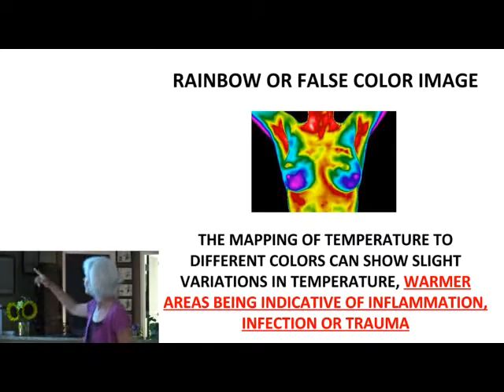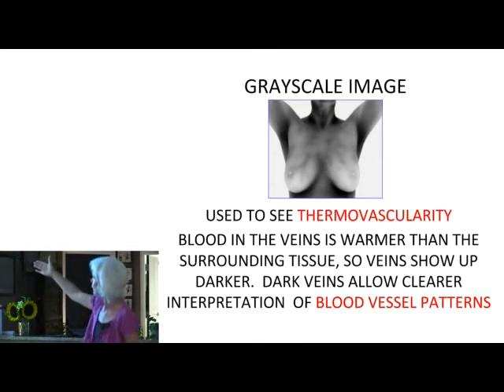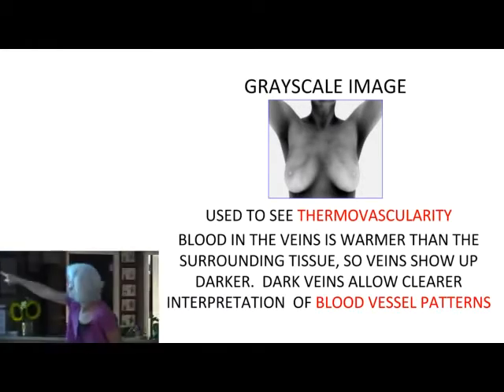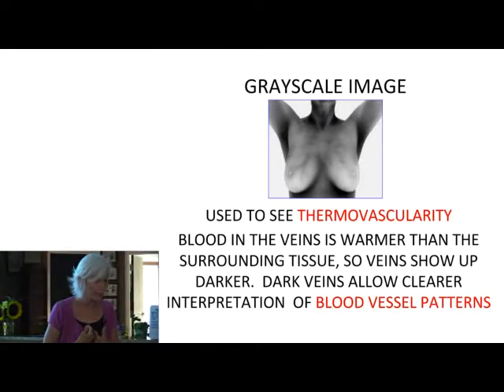So Effie, let's go on here to the grayscale image. We also view the images in grayscale. When I say physiology, this is better representative of what I'm trying to relay to you. This shows the blood vessel patterns. Do you see in the black and white? I'm going to show some more black and white, but this is called thermovascularity. What this means is the blood in the veins is warmer, so it shows up in this black and white. So that means we can visually see how the blood vessels are forming.